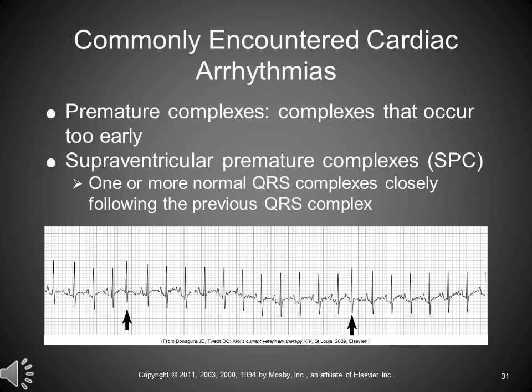And they give you a couple of examples there without adequate amount of rest between QRSs. They seem to start coming much too fast. Okay, the ventricles are starting to beat too quick, out of rhythm with the atria and out of rhythm with the entire cardiac cycle. Supraventricular complexes, not good.